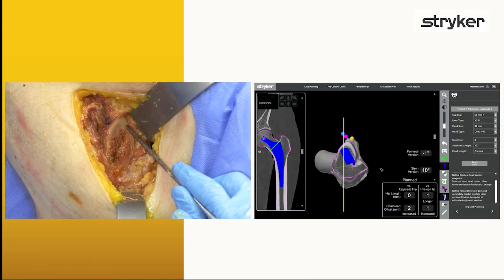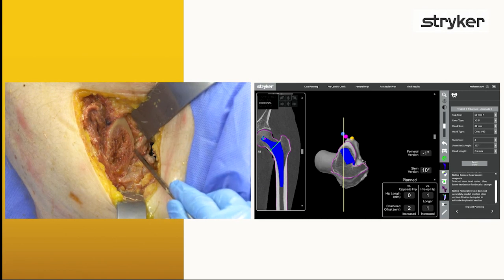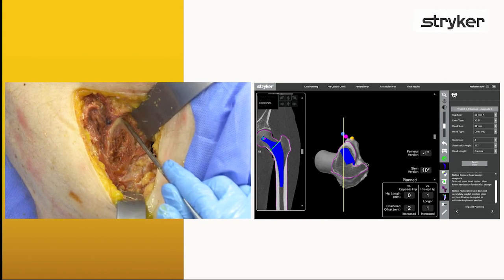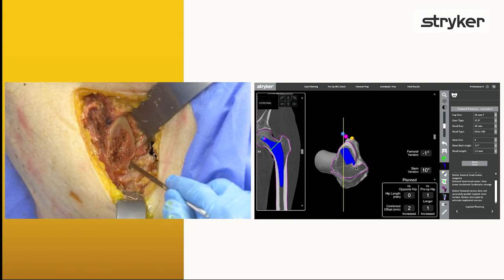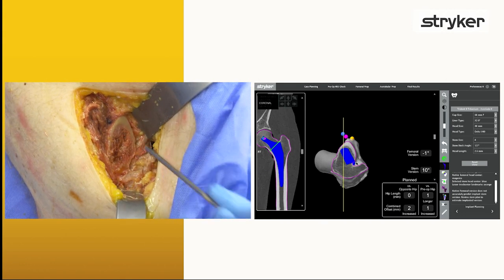So here we have our femoral exposure. This is the neck resection view on the right that gives us our angle of attack with our starting broach as we begin to prepare the femur. You can see that we have both the anterior and the posterior aspects of the neck visualized. We have the medial neck, medial calcar, and here is the far lateral point of the trochanter, piriformis fossa, right along here, and so we can see that our planned broaching angle will be right along this axis.